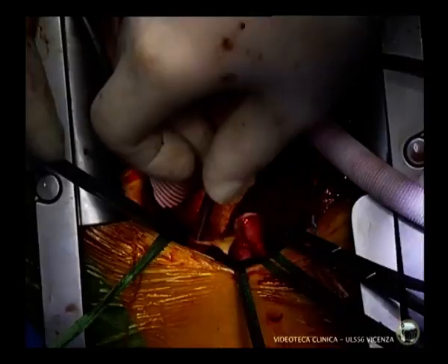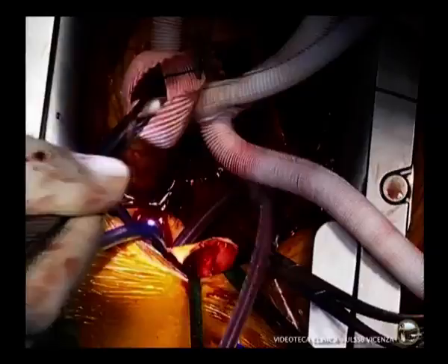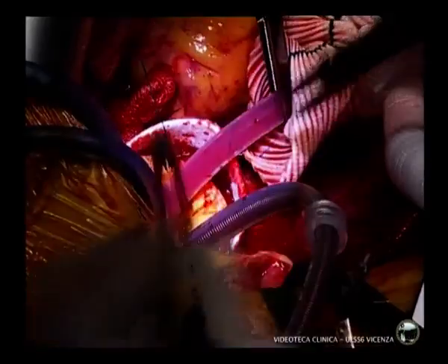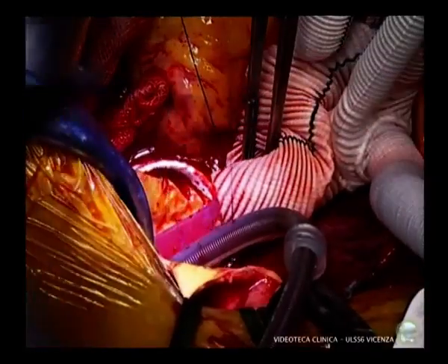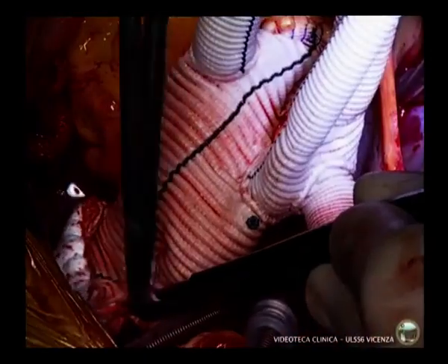The perfusion should be monitored and maintained at around 60 to 70 millimeters of mercury. The preparation of the aortic arch is now completed. The resection stops approximately 1 cm proximal to the origin of the left subclavian artery. A vacuum vent line is inserted through a branch of the vascular graft in order to keep the operating area bloodless.